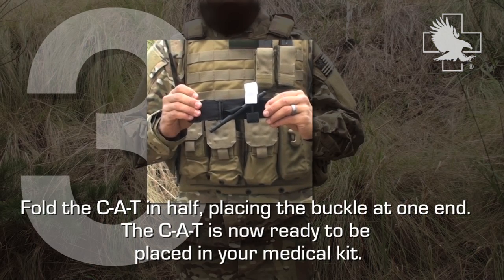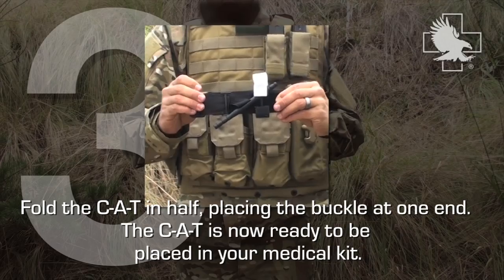Fold the CAT in half, placing the buckle at the end. The CAT is now ready to be placed in your medical kit.